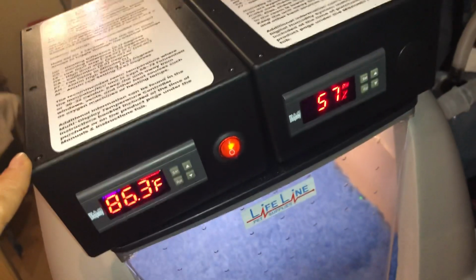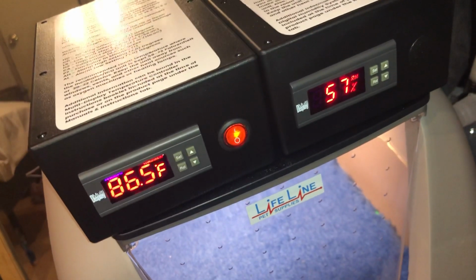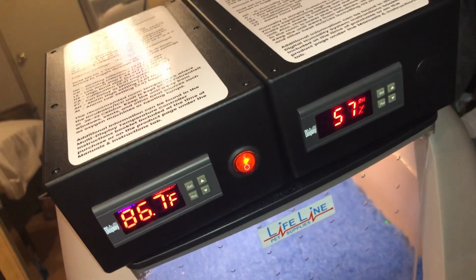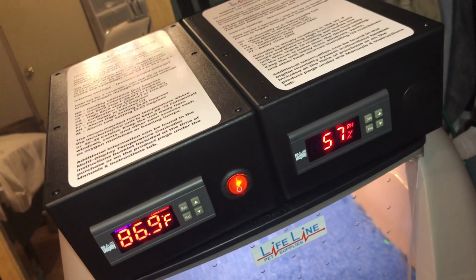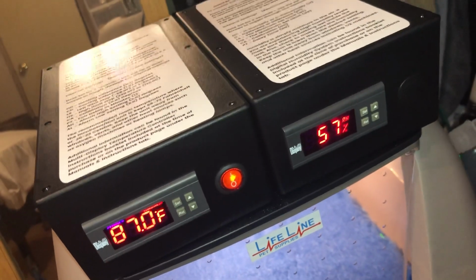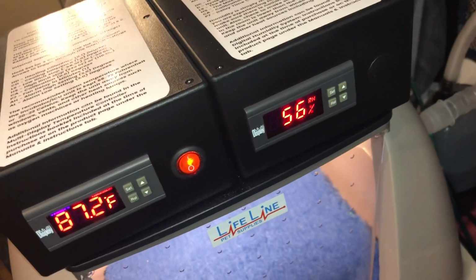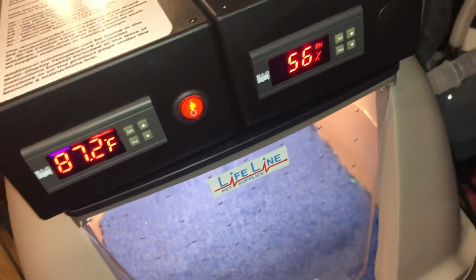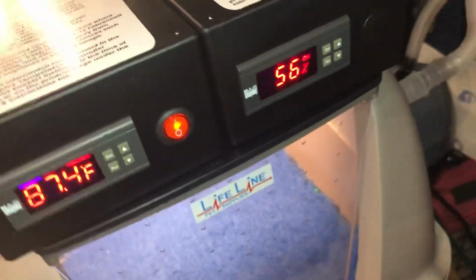This right here, I'm still playing with the temperature. Right now I just turned it on, so it's warming up, but I'm thinking since a mother's temperature is 100 to 102, I'm thinking about 98 is a good temperature for the puppy, because if you have them too cold, they're going to die. If you have them too hot, they're going to die. So don't take my advice. You kind of ask your vet, feel it out for yourself, because I don't want to be to blame if your puppies die, because they definitely can.